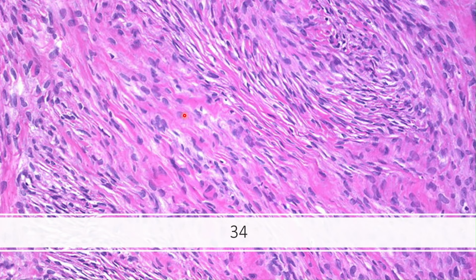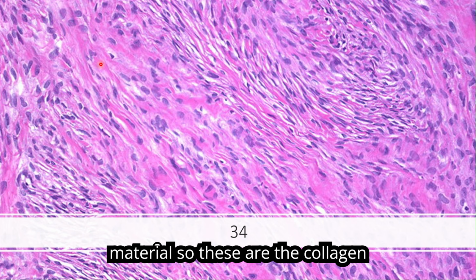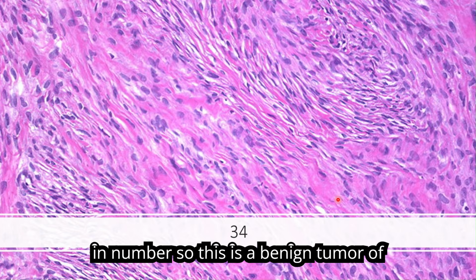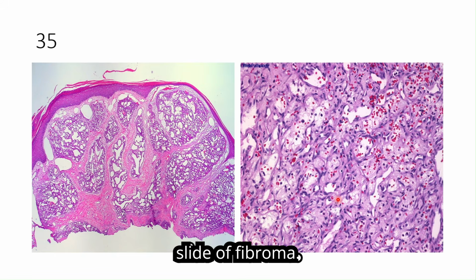Here you can see fibroblast proliferation with pink material. So these are the collagen producing fibroblasts, excessive in number. So this is a benign tumor of fibroblasts called fibroma. This is a slide of fibroma.